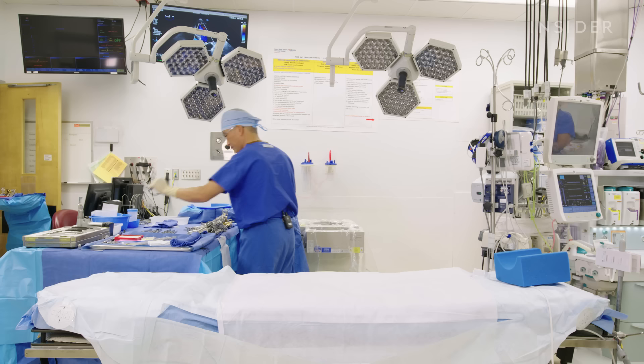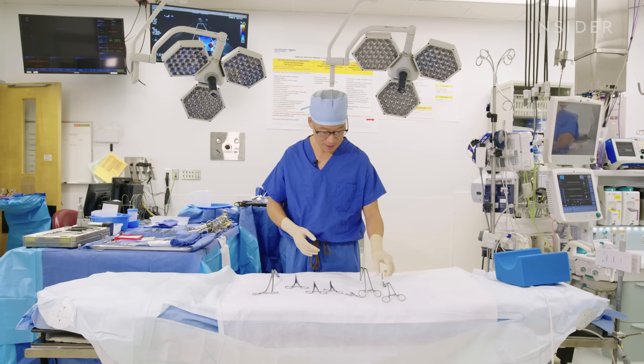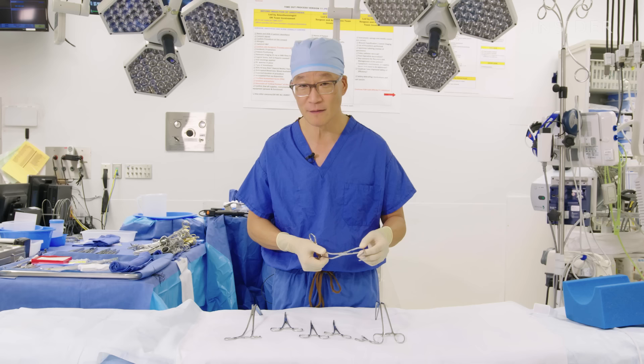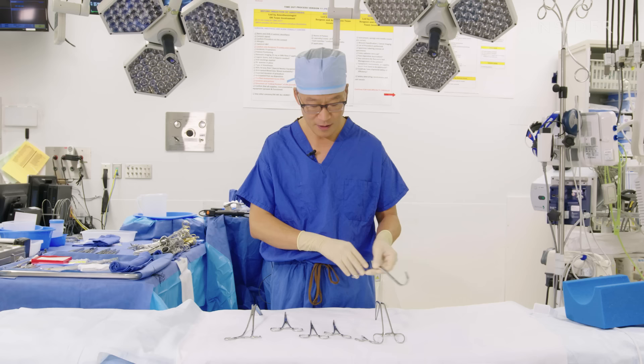This is a clamp — an aortic cross clamp. There are vascular clamps and non-vascular clamps. The vascular clamps have very specific types of jaws which are called non-crushing. The importance of non-crushing is that we don't want the cells that make up that particular part of the organ to be crushed or killed or devitalized because you're closing the clamp on it.